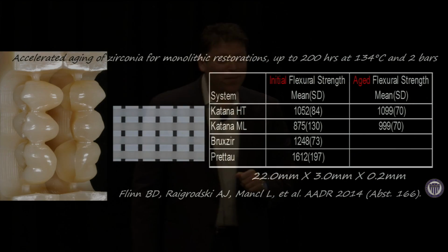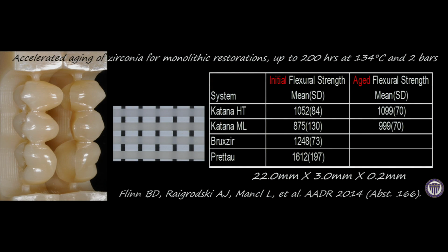But the question is, what happens after aging? And what we found was extremely interesting. After 200 hours of aging, the 2 first ones on the list actually became stronger. This is the first time we've seen something like that.